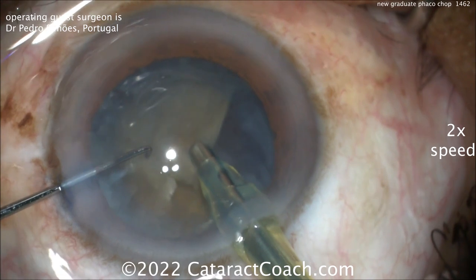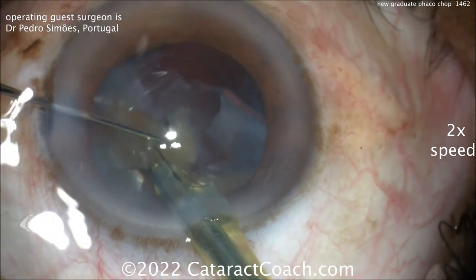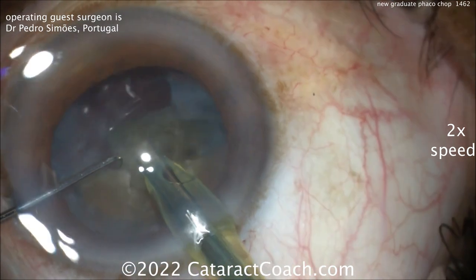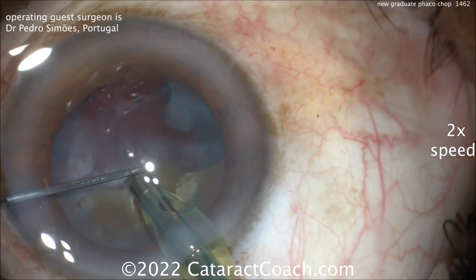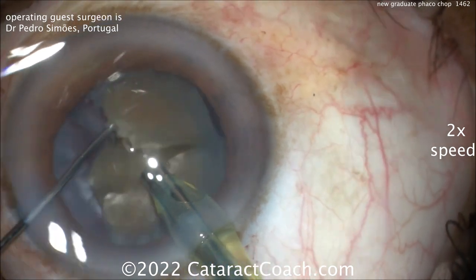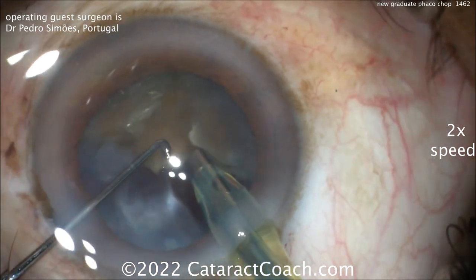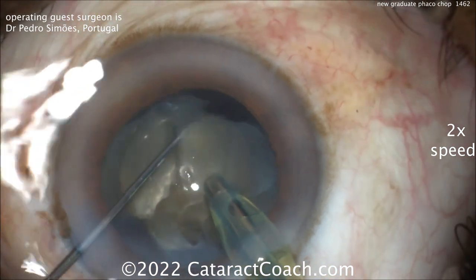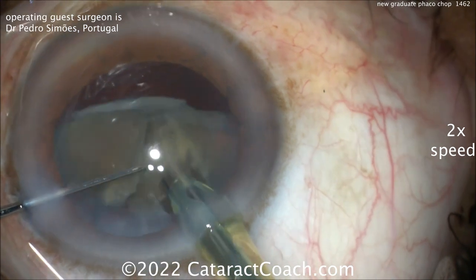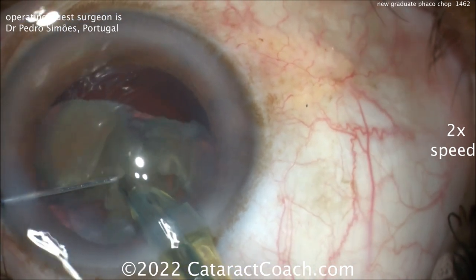This is very impressive — this is a very talented young surgeon. You can certainly learn Faco Chop as well; it just takes a little bit of practice. How do you get into it if you've only done Divide and Conquer? Well, the first step is to go to Stop and Chop — create one groove down the middle, make your two halves, bring up each half, and you can try to chop each half more at the iris plane. Now look there — you see a nice little dense endonucleus right there in the very center. That's where the most amount of density is. So chopping this more — if you don't get the initial chop, that's okay. Just take your time, reposition the lens, and then you can buzz it again. That's the densest part right there.